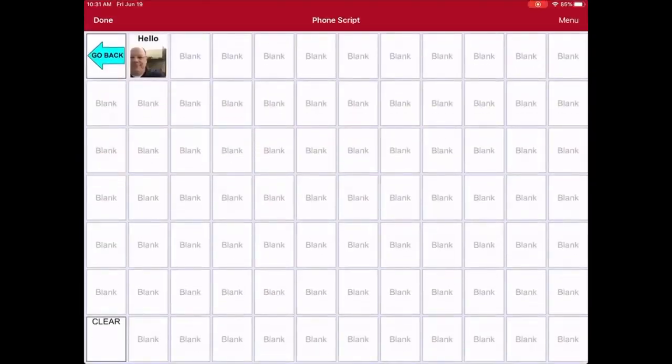And it doesn't have to be in the same location. So if I have 84 buttons here, if I want to have one section about getting a ride, or a section for movies, or a section to call the doctor, the pharmacy, any place that I want to call, mom, dad, you can pick a corner and start your conversation there in that page.